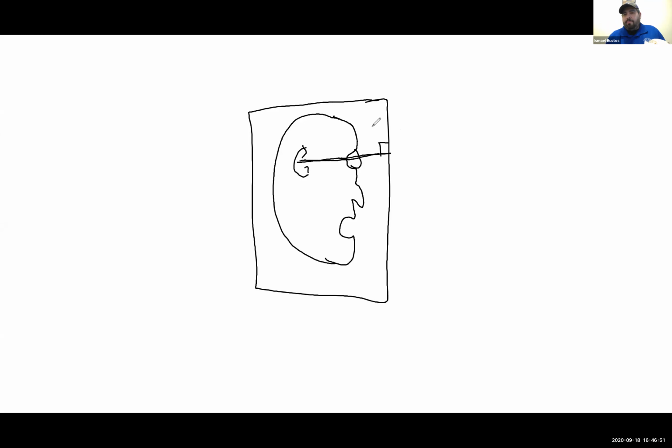I'm sorry, that means that there's going to be correct flexion extension of the patient. Which means that if I have my patient like this, and my image receptor's in front, I want to make sure I have enough flexion extension, which means that the OML needs to be perpendicular to the front edge. And we can see the OML is right there.